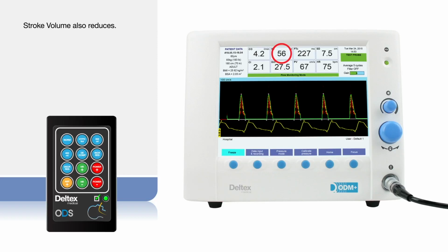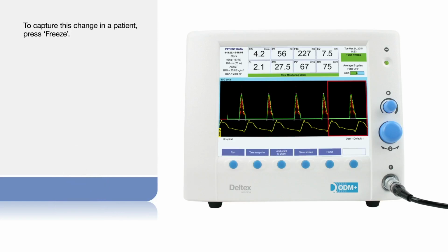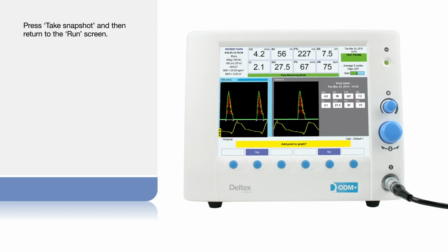In patients, these parameter changes will be specific to the individual. To capture this change in a patient, press Freeze and centre the red window over the waveform. Press Take Snapshot and then return to the Run screen.